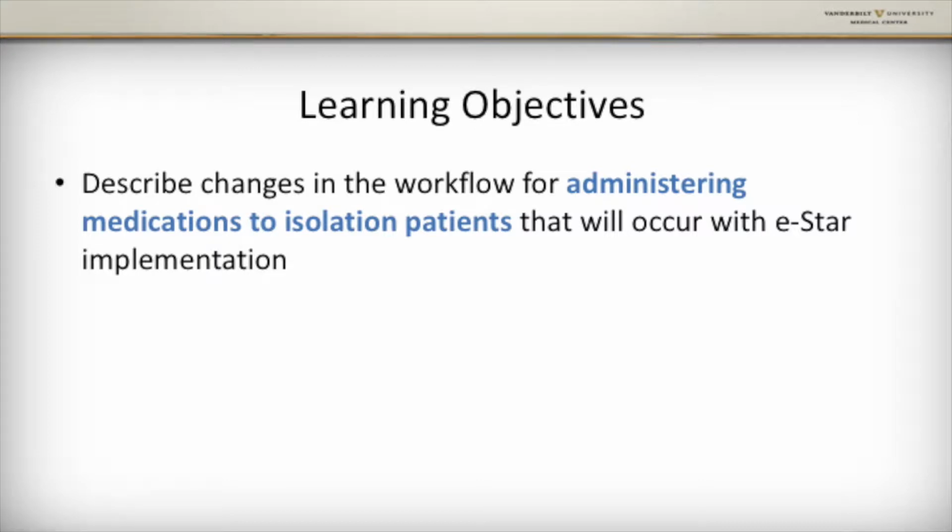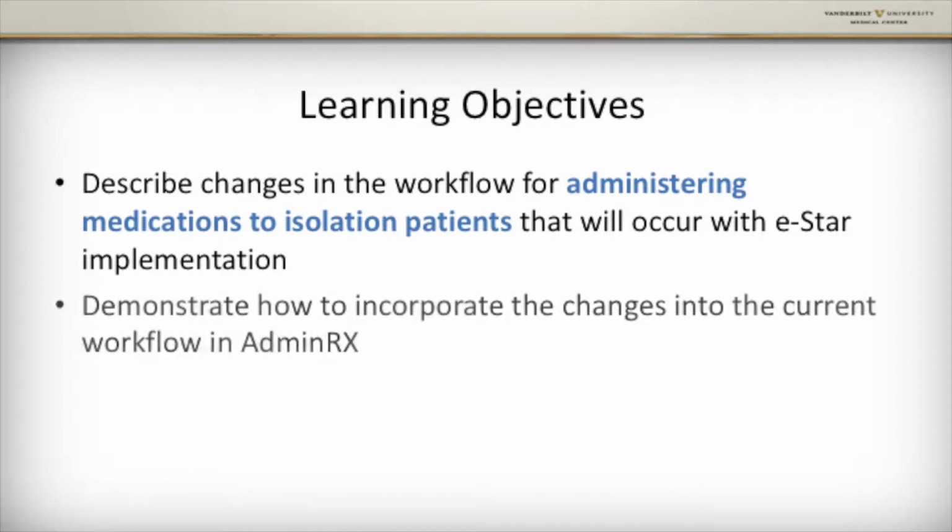After reviewing this module, you will be able to describe the changes in the workflow for administering medications to isolation patients that will occur with eStar implementation. You will also be able to demonstrate how to incorporate the changes into the current workflow in AdminRx. Incorporating these changes now will help you make the transition to eStar.